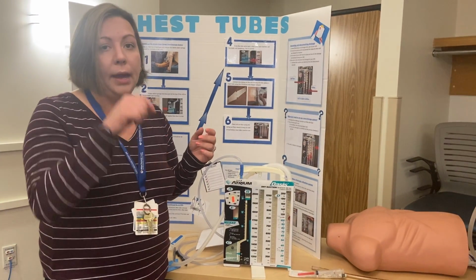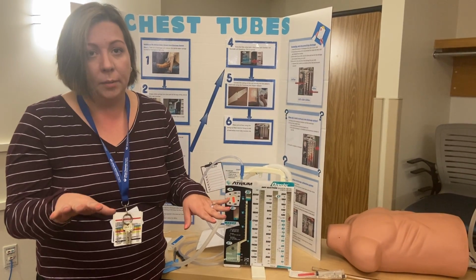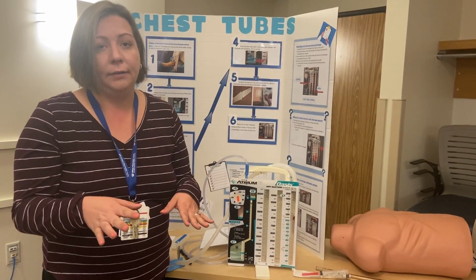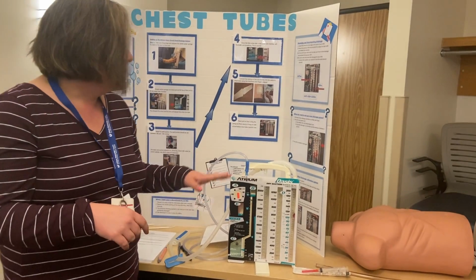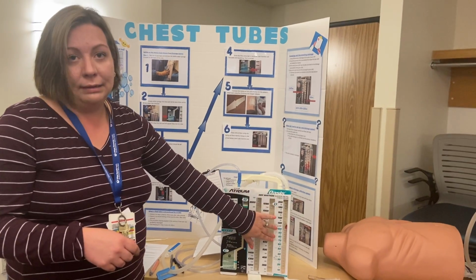But this is the internal suction, so you're not going to hurt the patient's lungs if you accidentally put the wall suction up a little higher and then you realize, oh, I need to put it between 80 and 100. There's no damage done. It's not directly affecting the patient's lungs, okay? But that's about what you need to get a good suction for drainage purposes into the canister.